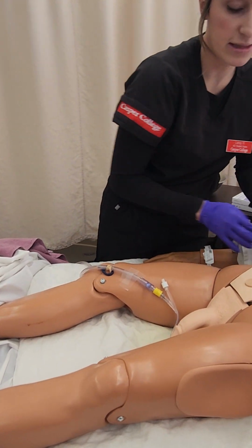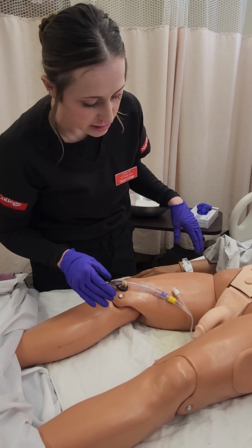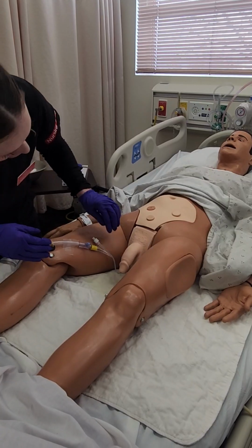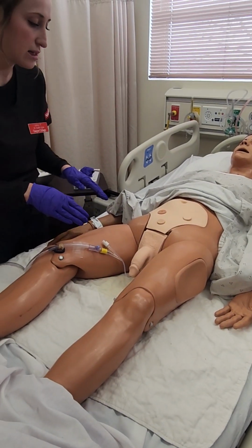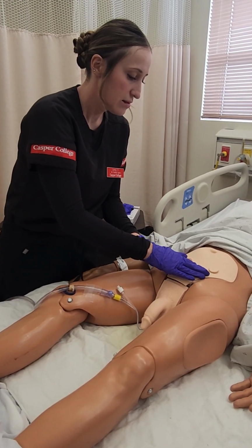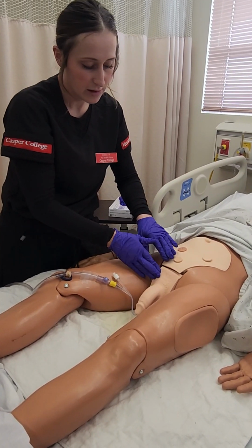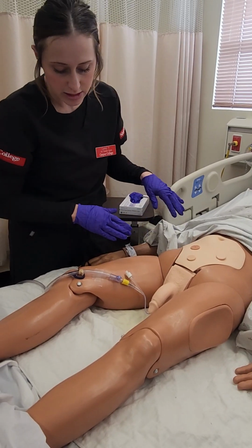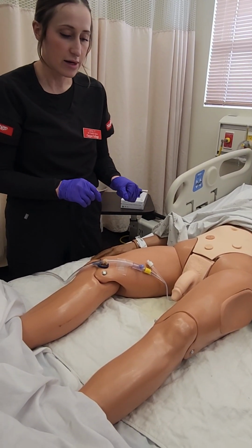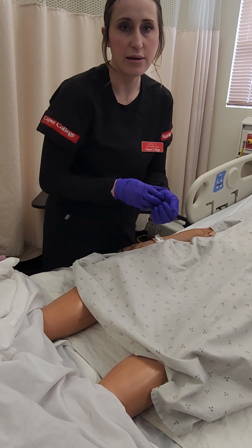All right, for the assessment, first I'm just going to inspect, looking for any swelling, lesions, skin breakdown, any rubbing from the tube, irritations, anything that I see. Is it okay if I palpate a little bit? Mm-hmm. Let me know if there's any tenderness. All good. Okay, so I would just note any abnormal findings that I discover. Okay, so I'm going to cover you back up and I'm going to empty your catheter bag.